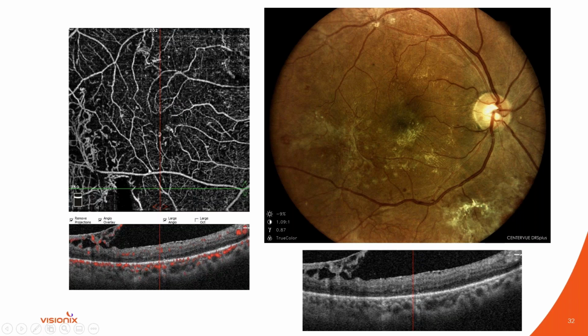So when you look at the angiogram, what you're going to appreciate here, and I always look at the fovea because that helps me to localize where I am, what you're going to notice is this big frond here of anomalous vessels. This is all neovascularization, this whole area. So embedded within this fibrous proliferation is the neovascularization, which would make sense, right? And neovascularization leads to this fibrous proliferation, which eventually can lead to a retinal detachment. And the other area of interest was up here. I said that it looked a little bit anomalous to me, and it certainly is anomalous. Here is the anomalous vasculature. So it's neat that you can actually identify very specific areas.